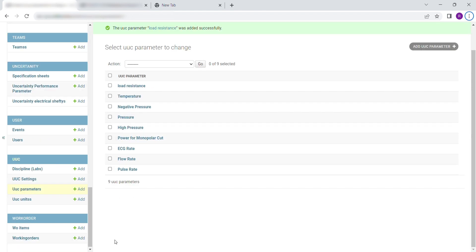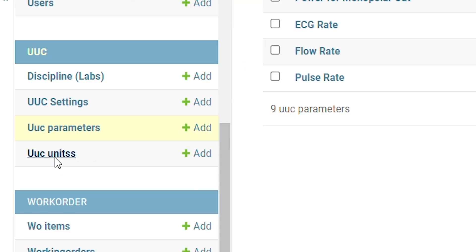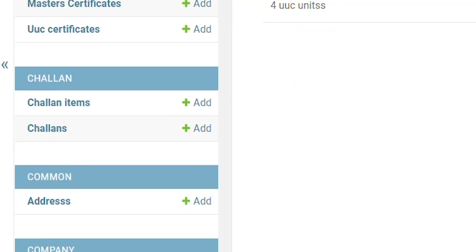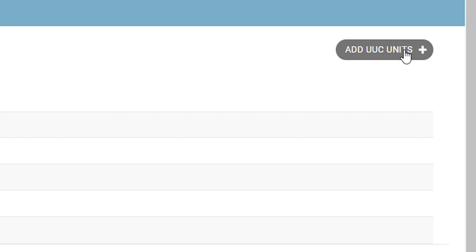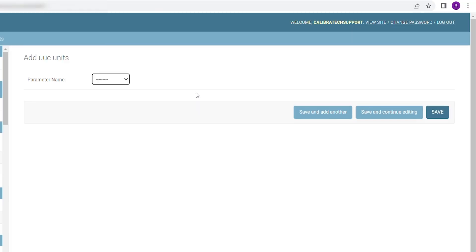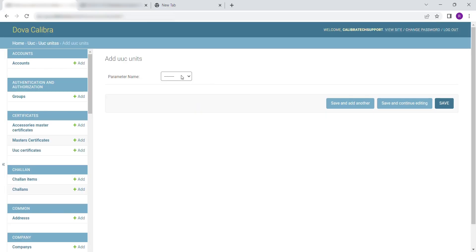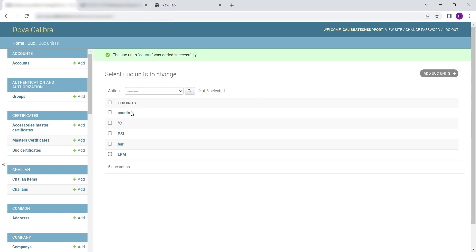To add UUC Units, scroll down to UUC. Select UUC Units and click on Add UUC Units. Select the Unit from the drop-down. Click on Save to save and exit.